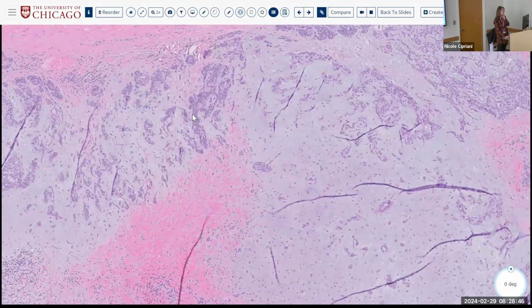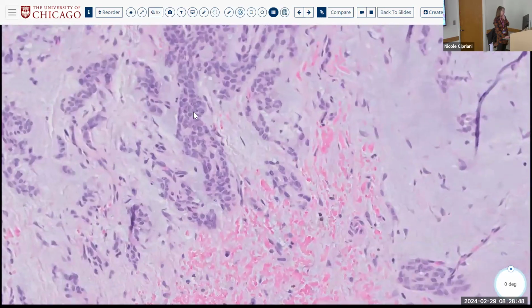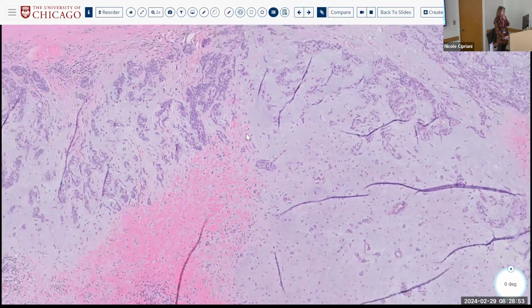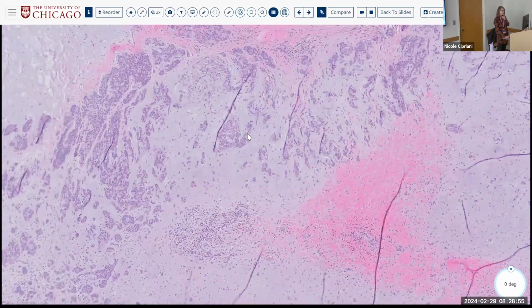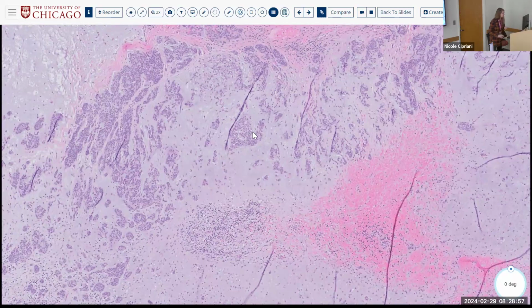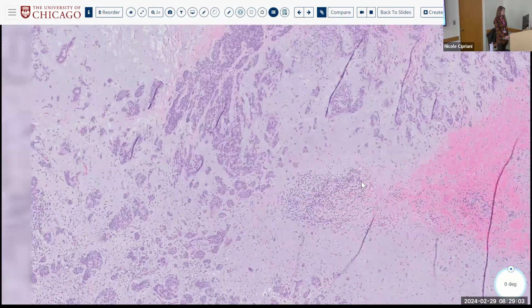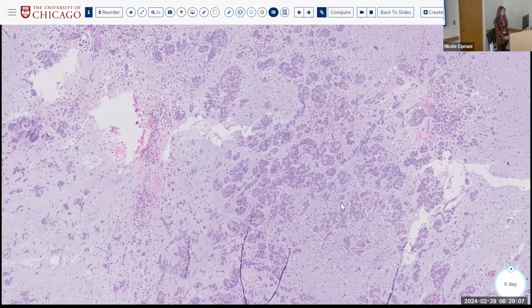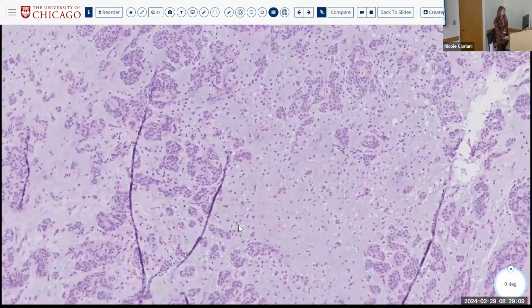You can do a mucin stain or a PAS diastase to help you out with that, but let's say there is none. Secretory? Oh, okay, so what in this case is present that you might not expect for that diagnosis of secretory carcinoma?